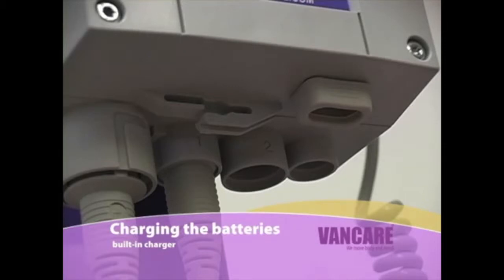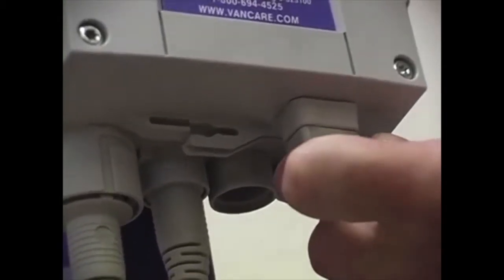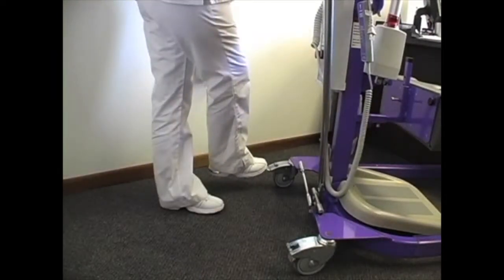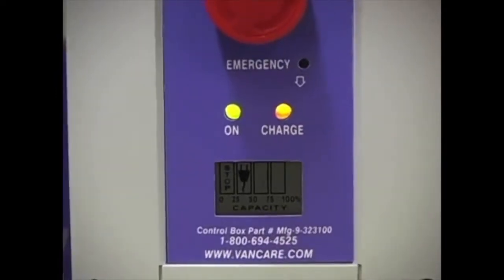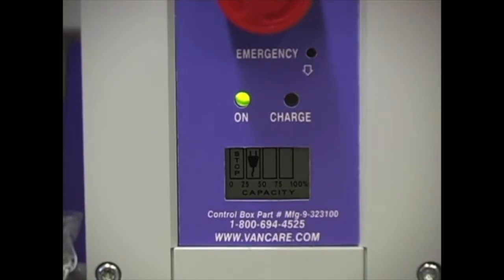Charging the batteries with built-in charger. Start by assuring the charging cord is securely plugged into the bottom of the control box. Position the lift near a wall outlet and lock the wheels. Locking the wheels while charging helps to prevent damage to the lift and wall outlet caused by someone moving the lift before they realize it is still plugged in. Plug the lift into the wall outlet. The yellow LED charge light and green LED on light will come on indicating the lift is charging. When the battery pack is fully charged, the yellow LED light will turn off. The battery gauge will continue to show empty until the lift is unplugged. The lift will not operate while it is plugged in. Also note that the lift will not charge if the emergency stop button is pushed in.